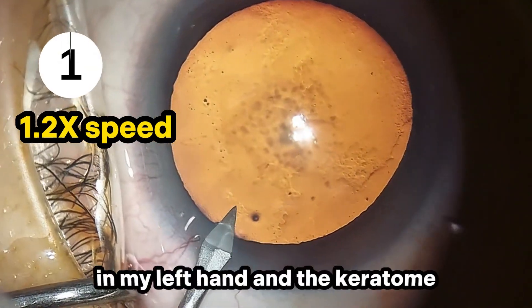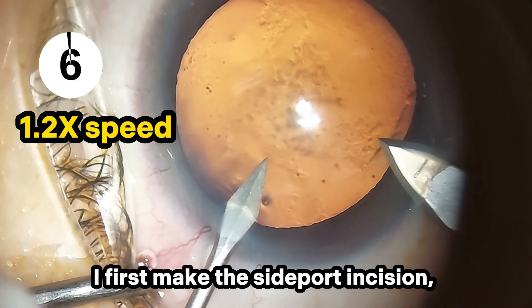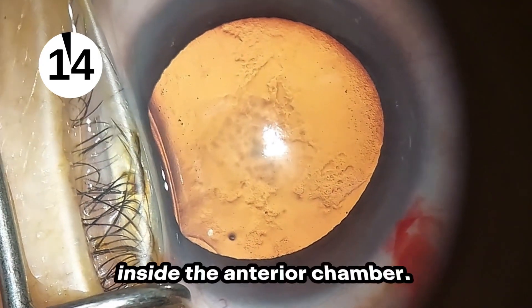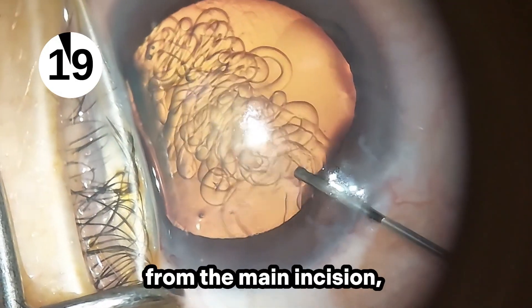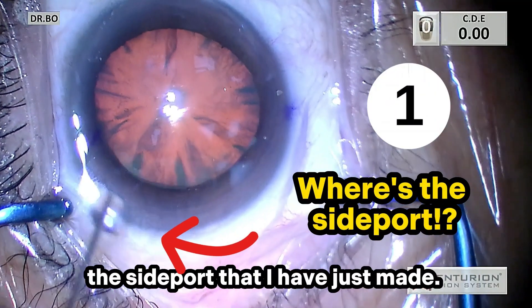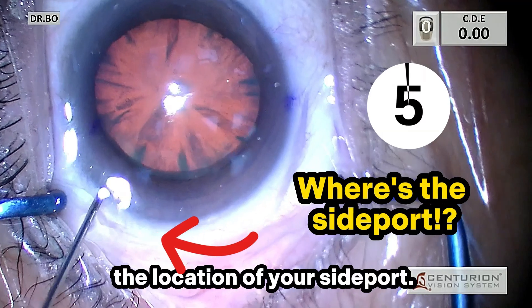I have the side port knife in my left hand and the keratome in my right hand. I first make the side port incision and, without removing the side port knife, I stabilize the eye to create the main incision without having viscoelastic material inside the anterior chamber. I then inject the viscoelastic material from the main incision, which saves time for young surgeons who struggle to find the side port they have just made — probably another 6 seconds saved.